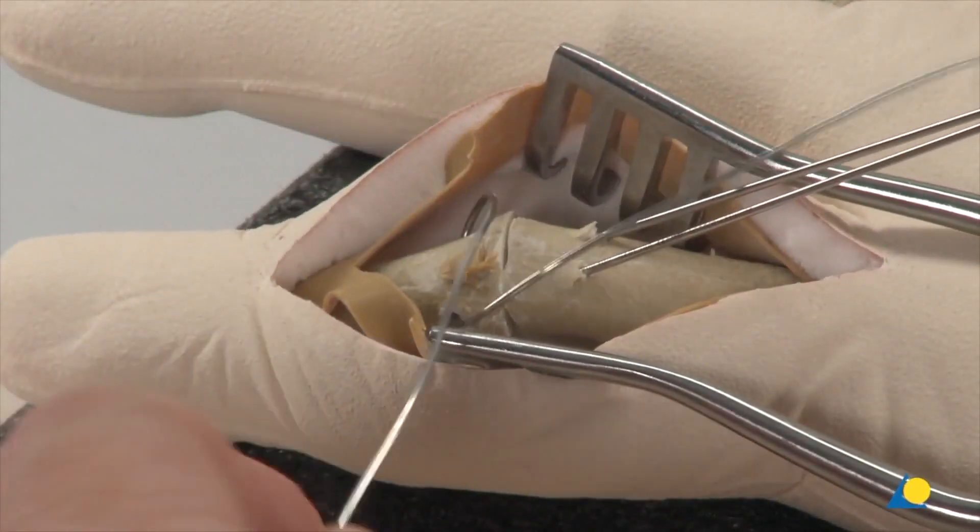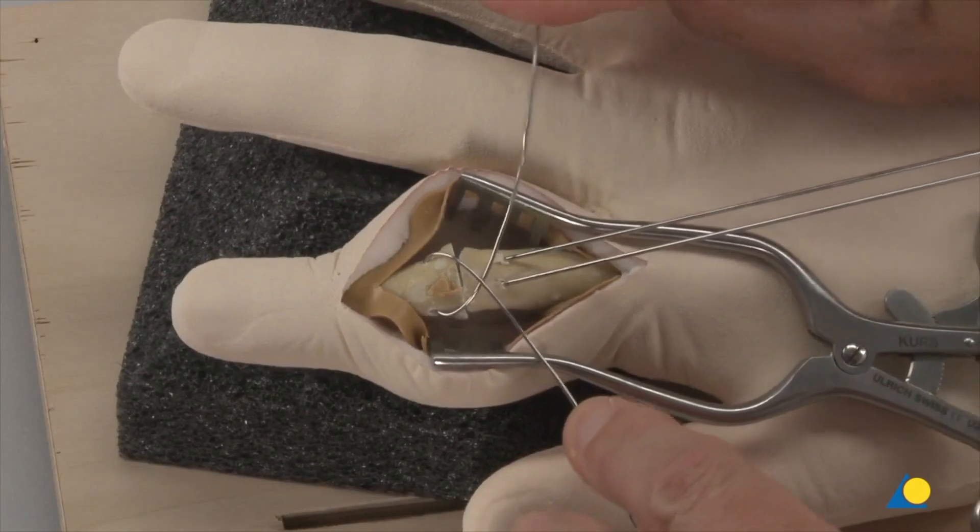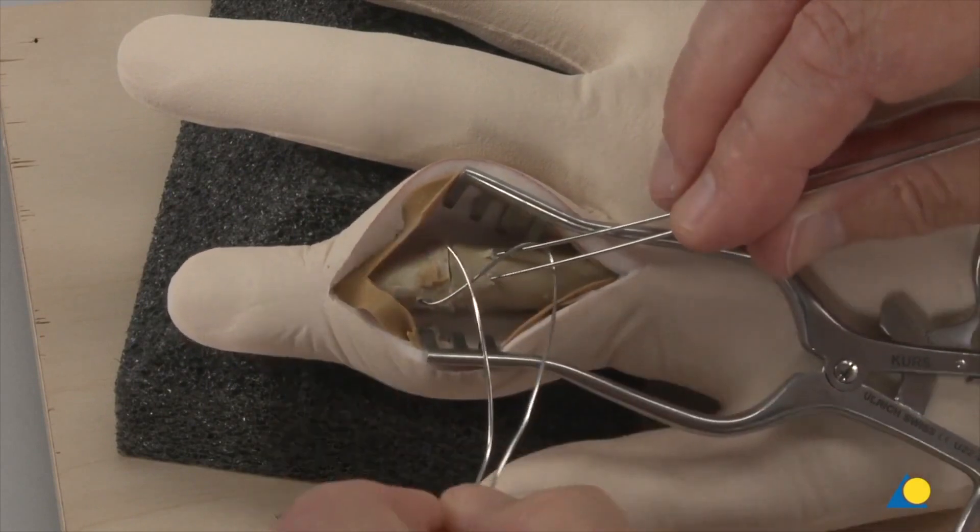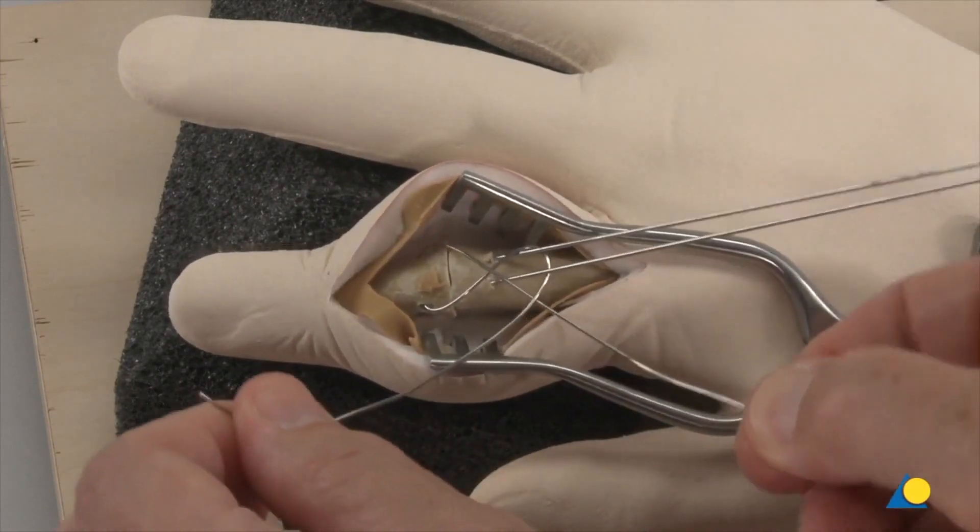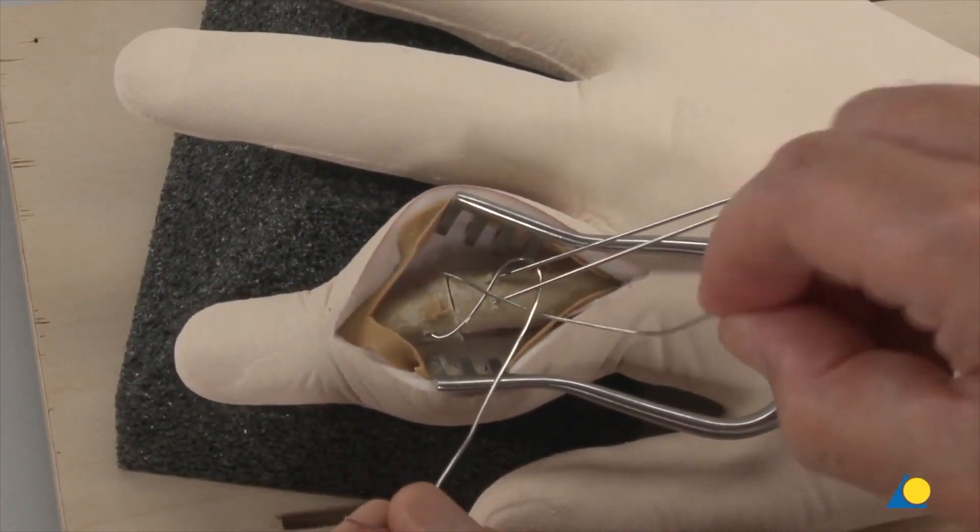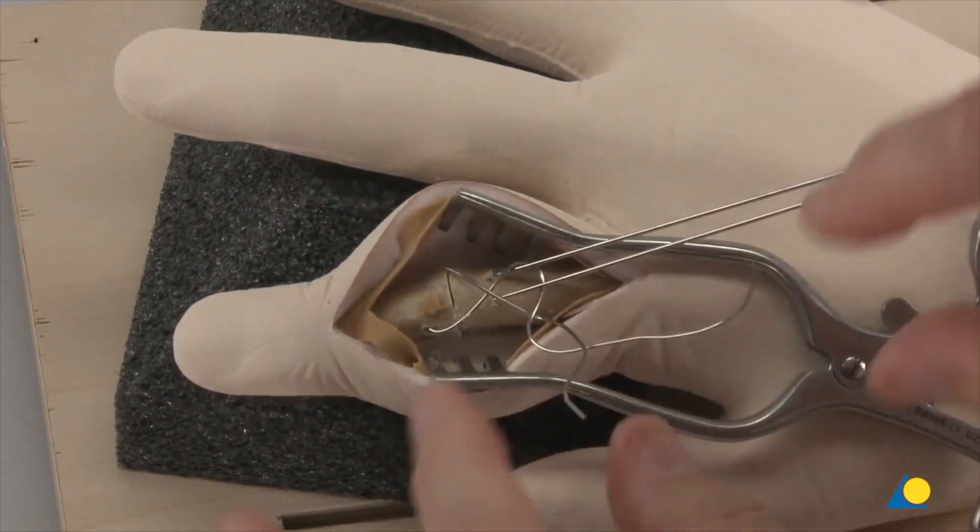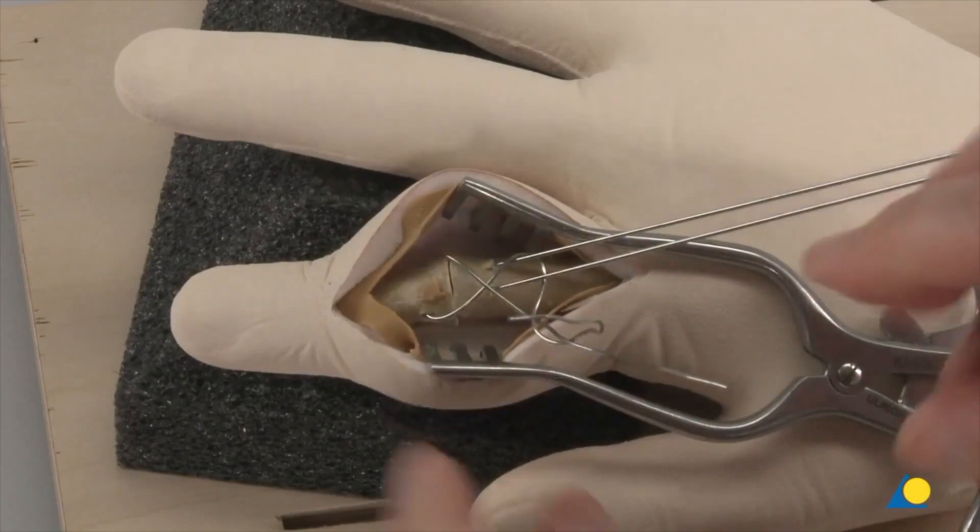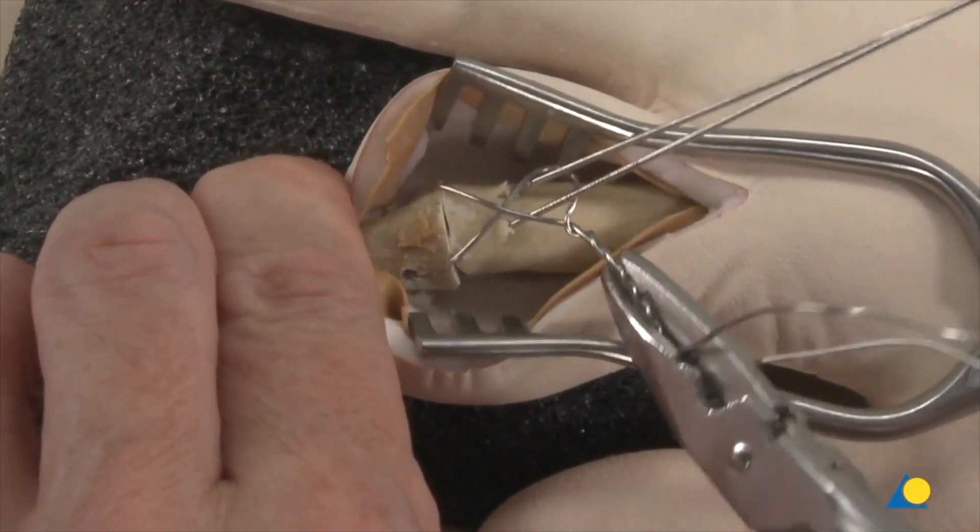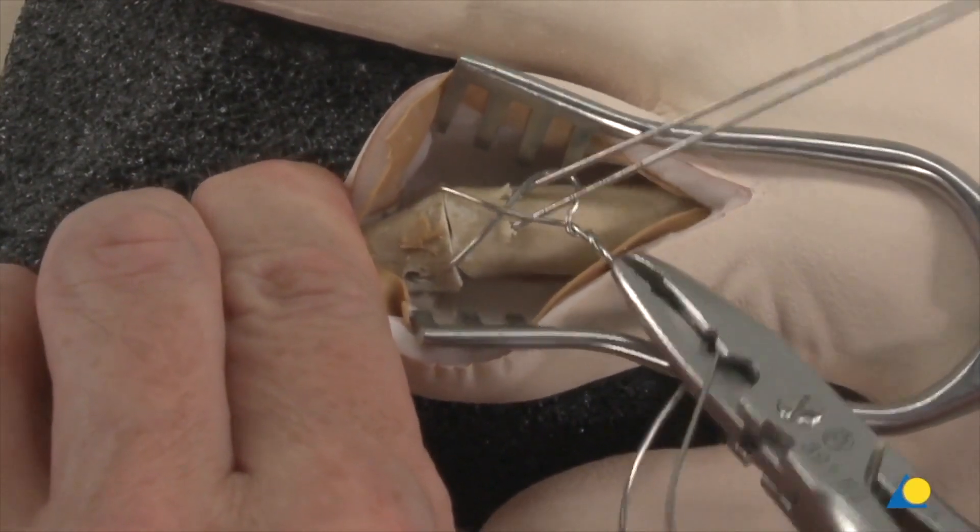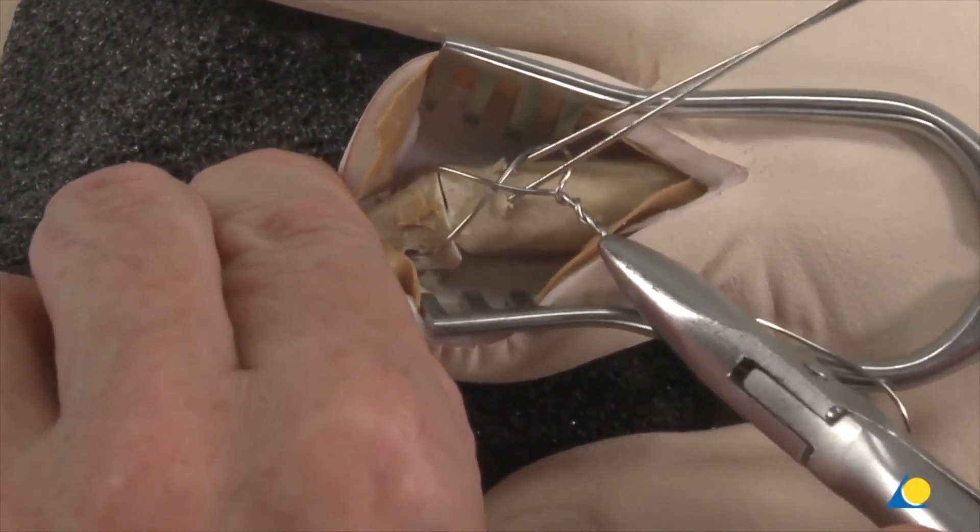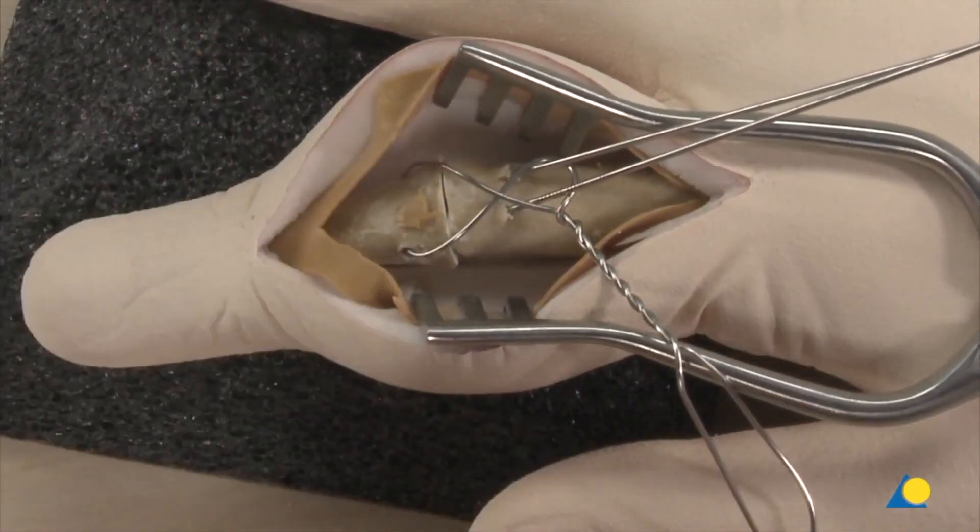Both ends of the circlage wire are wound as a figure of eight around the two K-wires and twisted together as shown. Using the wire bending pliers, the twisted wire is further tightened. It is important to exert continuous pull on the circlage wire ends, so both wires are twisted around each other. Twisting only one wire around the other can lead to slippage of the twist on the circlage wire.